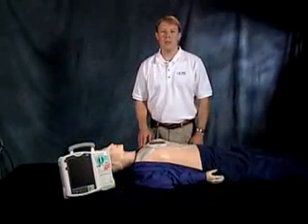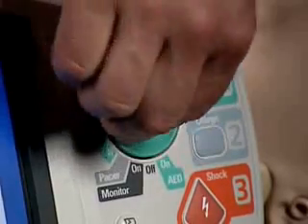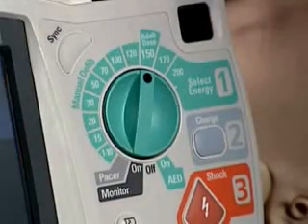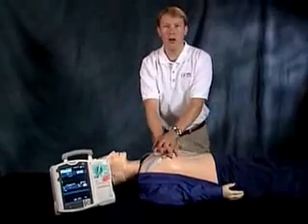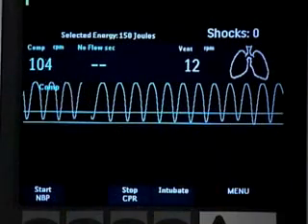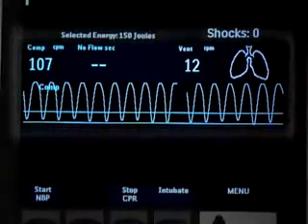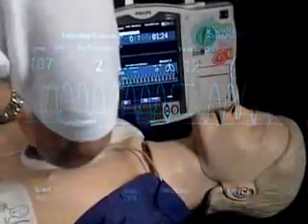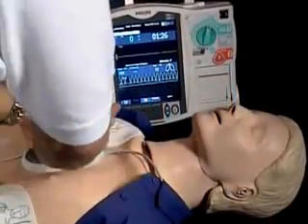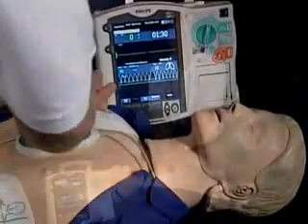Now that the setup is complete, I'll select our adult defibrillation setting of 150 joules. The CPR coaching will begin when I start my compressions. The MRX will provide both audio and visual coaching as I do my chest compressions. If my performance falls outside of the American Heart Association guidelines, I'll be prompted to make a correction. Otherwise, the device will be silent.